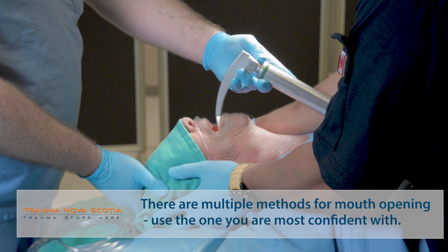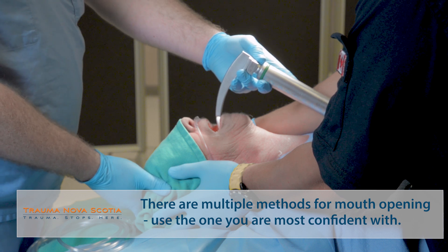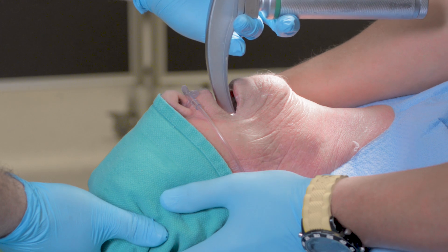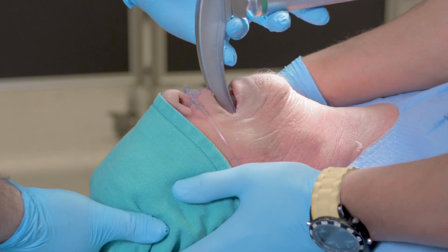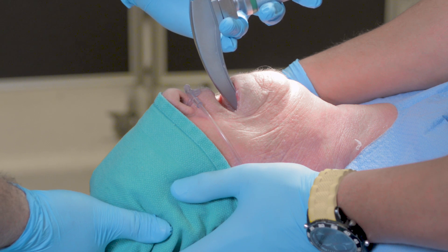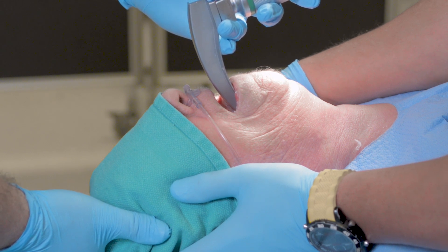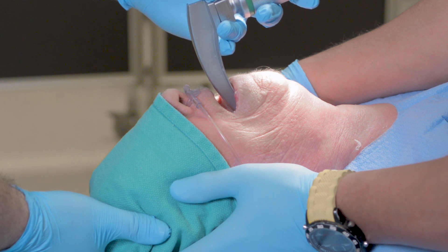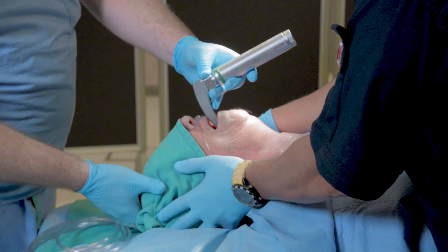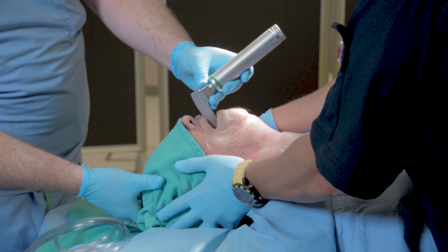Because this is a trauma patient, we're unable to manipulate this patient's neck. The laryngoscope is walked gently in the midline, down the tongue, lifting as you go. Essentially, all we're trying to do is identify the epiglottis. Once we've identified the epiglottis, we know where our airway is, although we may not see it. We're going to walk the blade down the tongue, looking for and identifying the epiglottis.